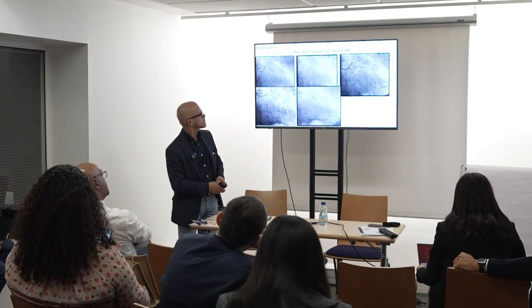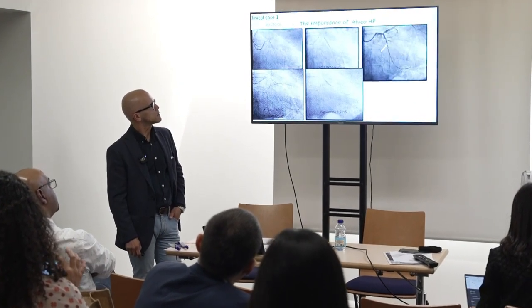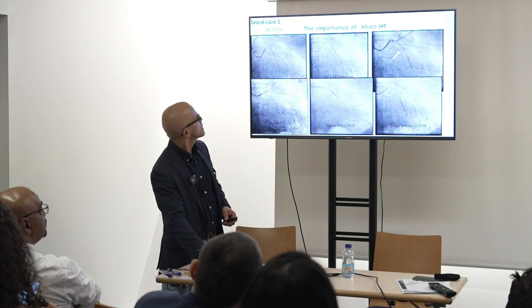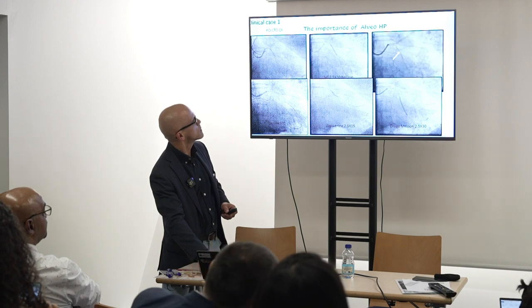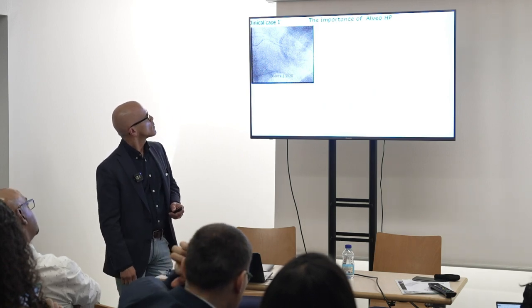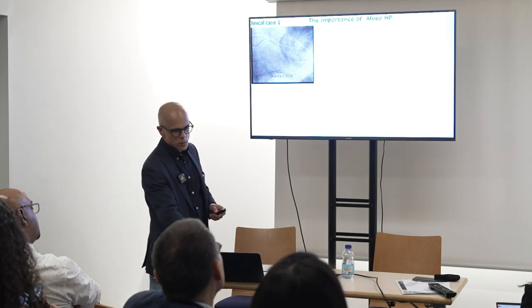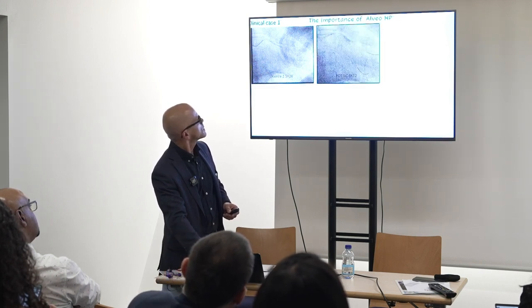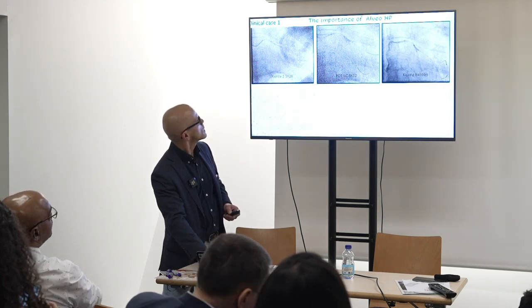Because of the calcified nature of the lesion on the marginal, we predilated with a non-compliant balloon and then with a cutting balloon. And finally we put a long stent in the distal part of the circumflex, not involving the bifurcation. Our intention was doing a culotte, putting a stent from the proximal part of the circumflex to the big marginal. This was post-dilated with a POT balloon and then we did a first kissing balloon.